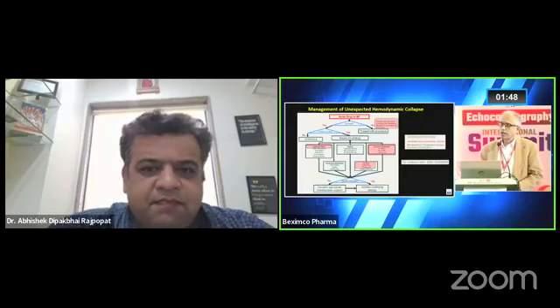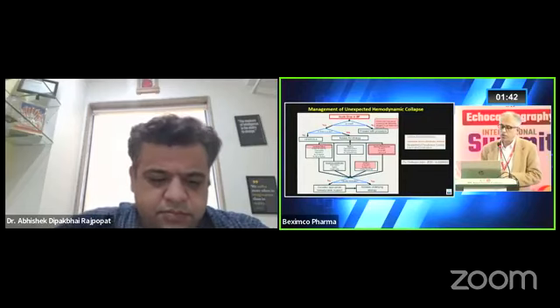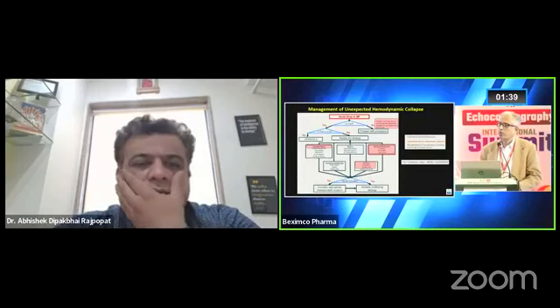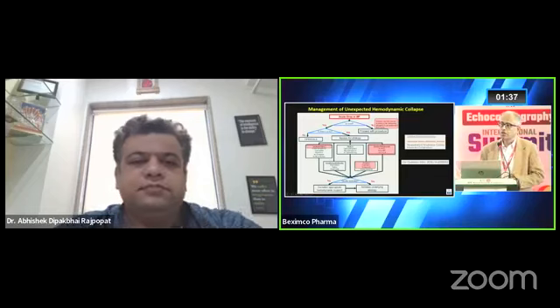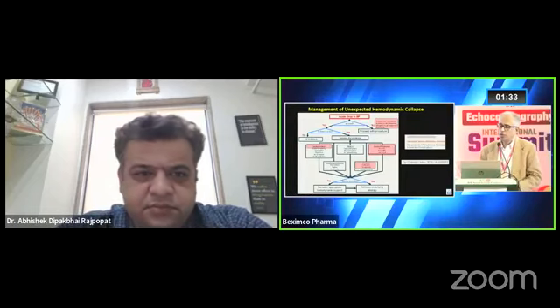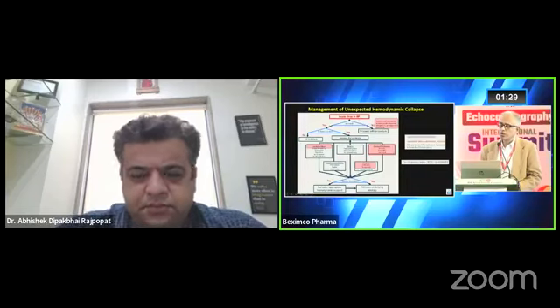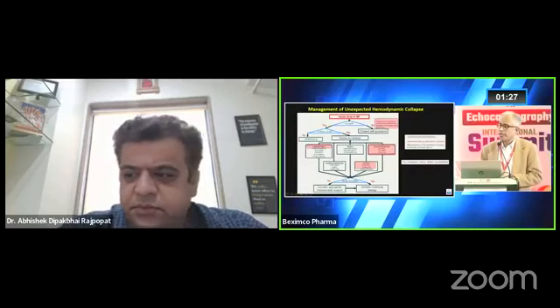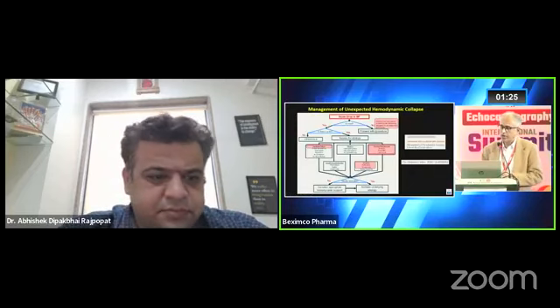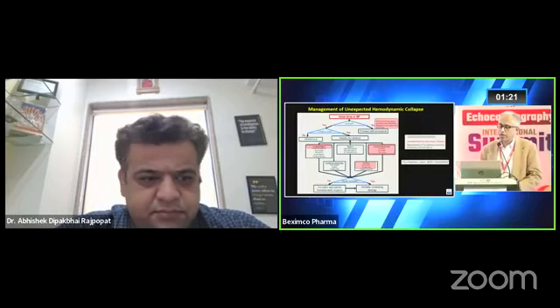Now, putting everything into perspective. If there is an acute drop in BP, if there's a hemodynamic collapse, what does echo do? You have the interventions on one side, they have their own approaches, but what can you do with an echo machine? One can look at an iatrogenic aortic regurgitation, which is very rare, that can happen when they do something to the aortic valve. So this has to be kept in mind.